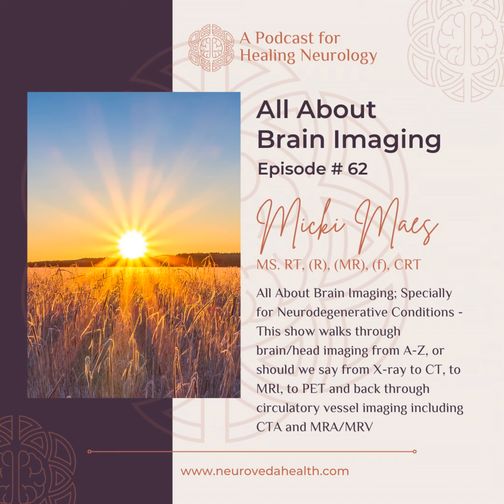So we're going to see that deep vein thrombosis if we're doing the venogram, looking at the venous flow versus looking at arterial flow. So MRI is great for both of those, and there's no ionizing radiation. However, it costs a little bit more and it takes a little bit longer. And of course, it has those contraindications if there's any metal in the body.